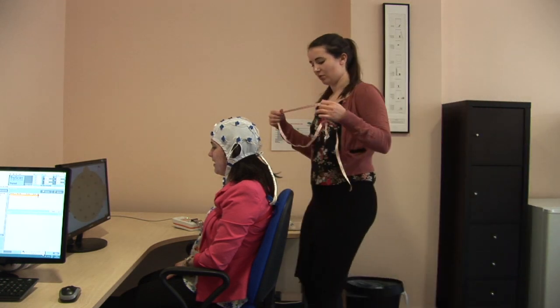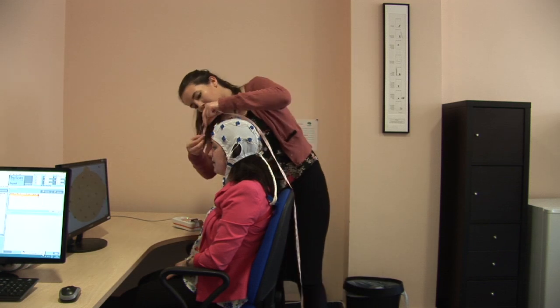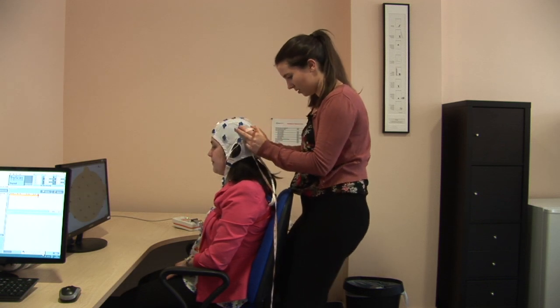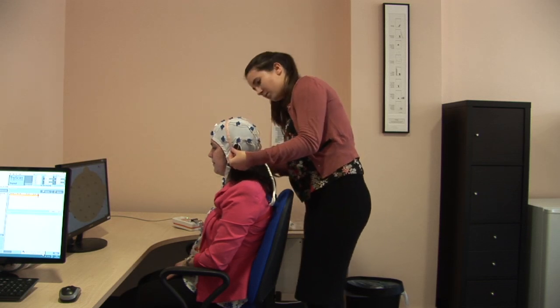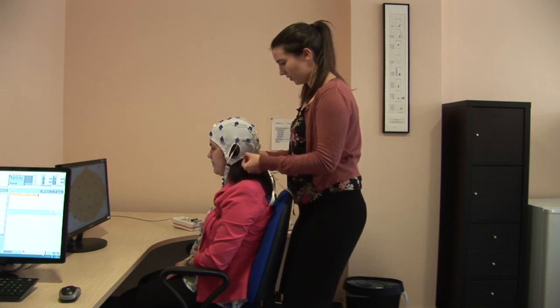And next thing, just going to make sure that the cap is in the right position. So using that measurement that we took, move the cap slightly. And then just to make sure it's centered as well. Yep, that's perfect. There.